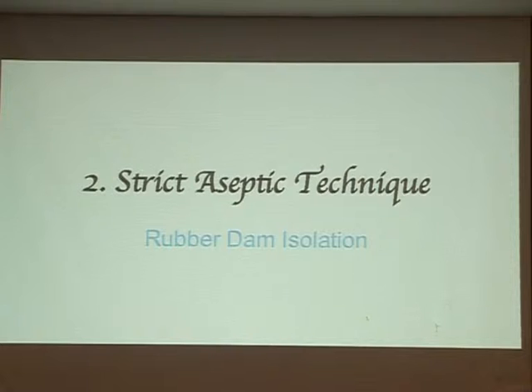The second important key issue is the rubber dam. Okay, I know it's not very popular. Even in our area, only 30% of dentists use rubber dam for endo. But this is a very important step before you commence any endodontic treatment.